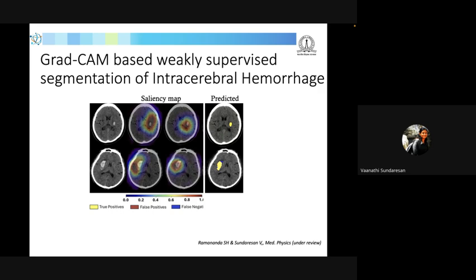And here we do not have manual annotations, but we have quite a lot of data. So there are two extremes to it. Here since we had a lot of data, the only problem is we do not have segmentation labels, but we had only image level labels. We are tackling it using some weakly supervised method here.